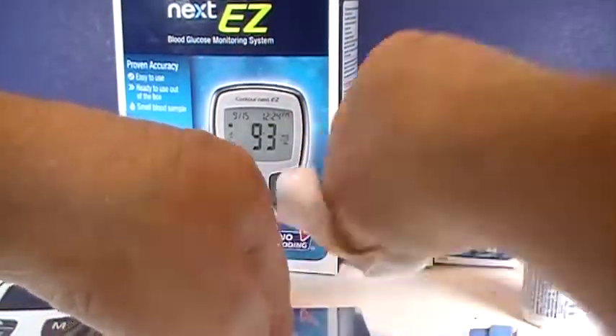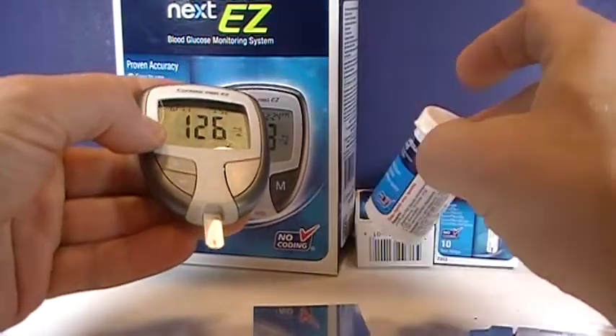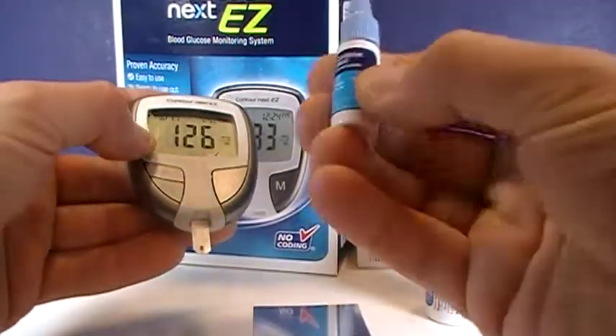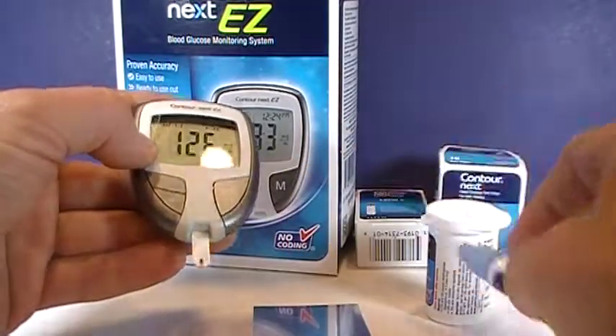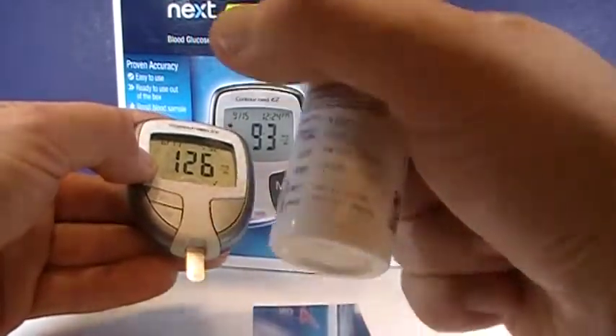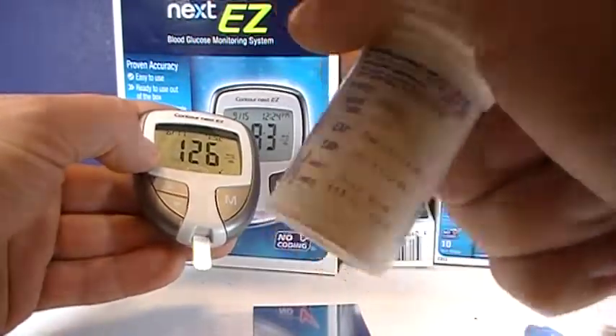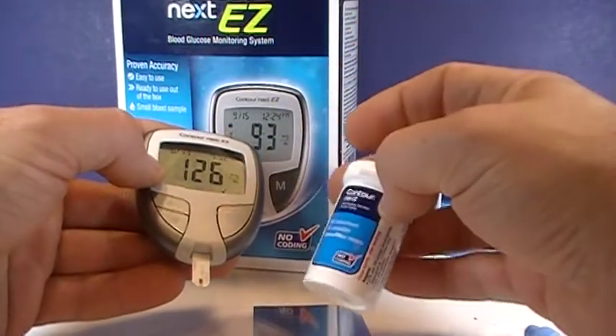So that's what you do with the control solution. It's testing your strips as well as your meter to make sure that they're working properly. You need to get the control solution specific for this monitor, and when you have the reading, you need to compare it to the bottle of test strips that you used. These ranges are going to be different on each bottle of test strips, so look at those control ranges directly on the bottle that you used.